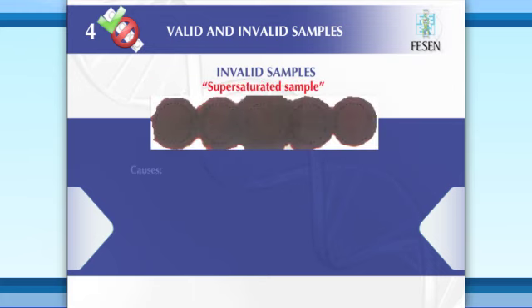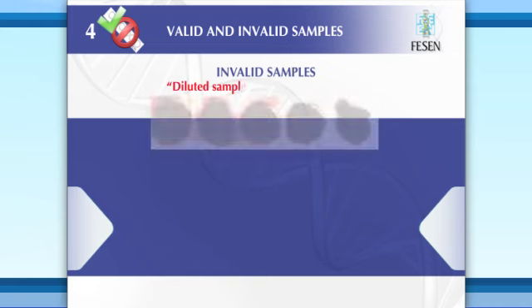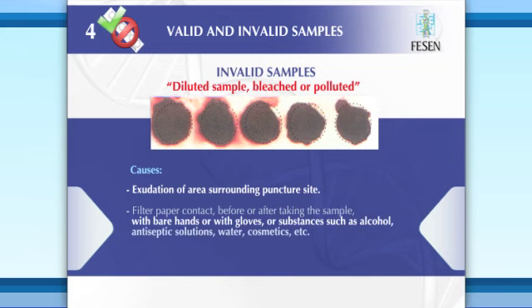Supersaturated sample. Causes: excessive blood application on filter paper. Blood impregnation on both sides of the paper. Diluted sample, bleached or polluted. Causes: exudation of area surrounding puncture site. Filter paper contact before or after taking the sample with bare hands or with gloves, or substances such as alcohol, antiseptic solutions, water, cosmetics, etc. Sample exposure to a direct heat source.